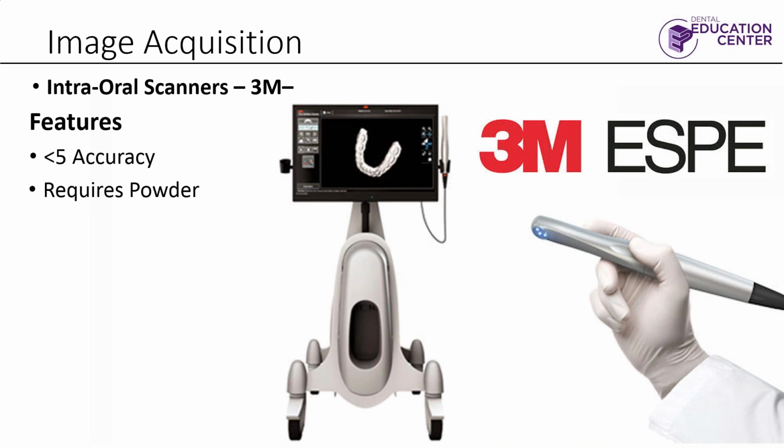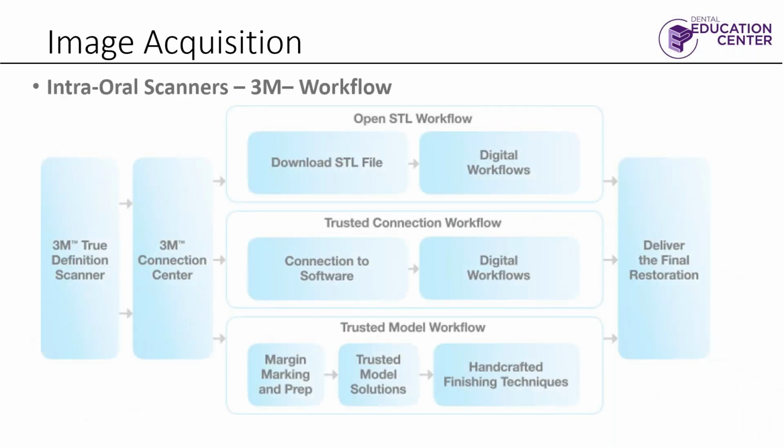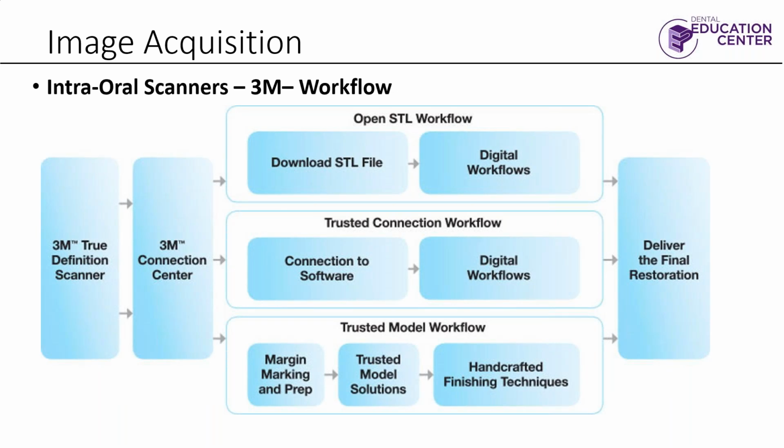3M, they came on pretty early. I put them in here. They're not one of the better ones, but they're a little less expensive. They take powder. But they do also have a monthly fee, which is tough. I put this in as kind of just, this is their workflow. Like, it goes from their scanner to the cloud, back down, gets refined.